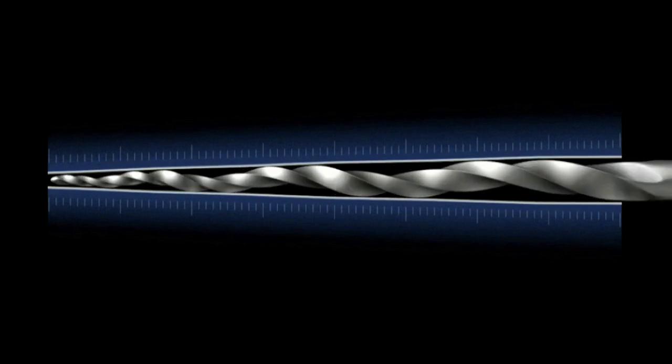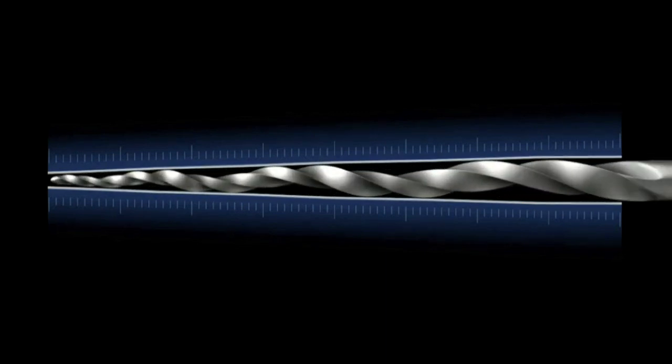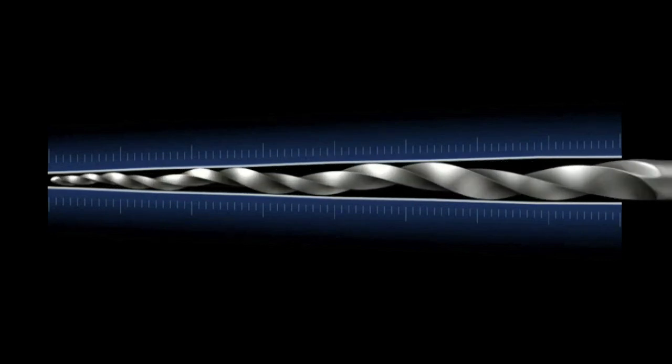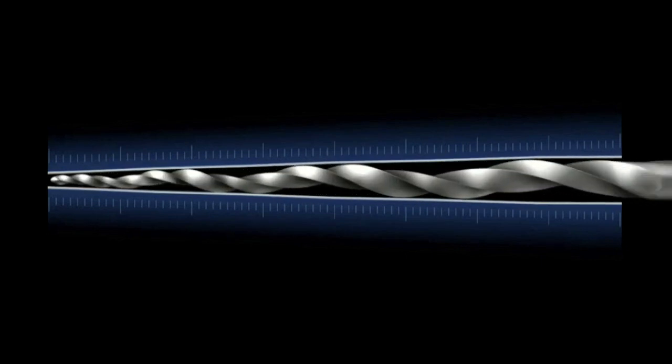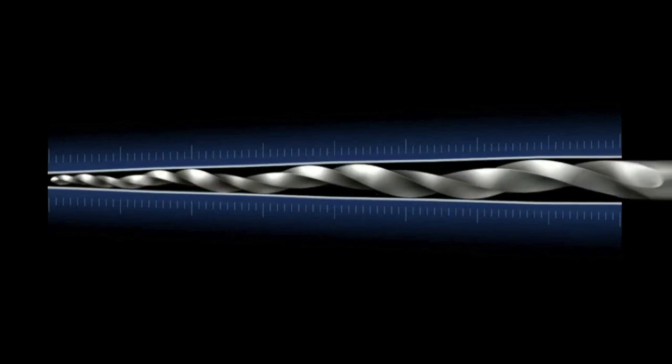And to me, that's the big distinction of ProTaper Next. Once again, you've seen this before, it should be hitting home now: you're cutting with the same efficiency, perhaps more, but you're cutting with fewer blades touching, which in my hands means I have more space to be safe, and also more space to collect dentin that I want to shape. And of course, you're going to remove these instruments. You're not going to let it sit there. This is animation. You're going to remove them, clean off the flutes, irrigate, and proceed again.